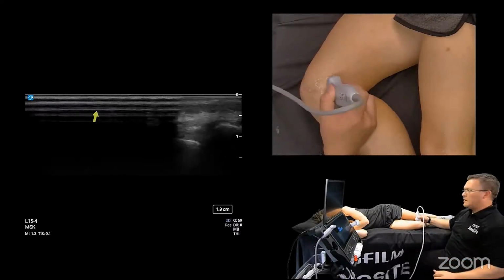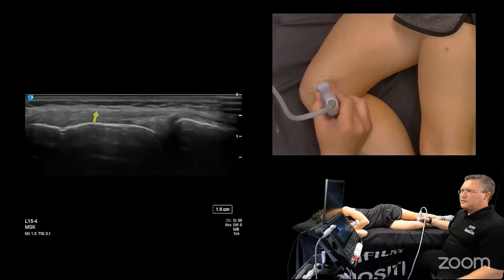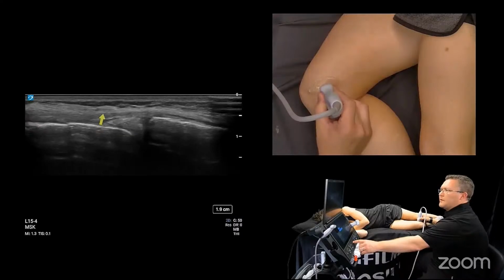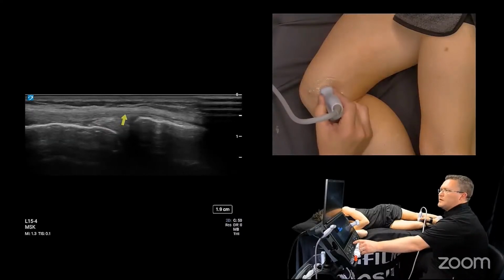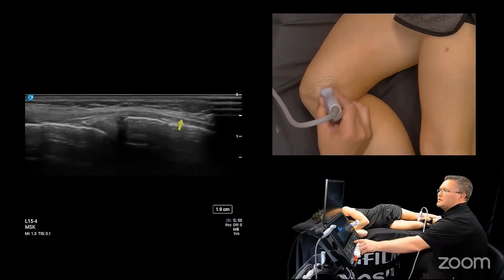So I just want to point that out, kind of why we join a live webinar to get some scanning tips instead of PowerPoint slides, right? So I'm just scanning posterior, my finger is posterior to the joint now, but it's keeping me on the ligament. And as I scan distally, I can see how thin the MCL is right here.